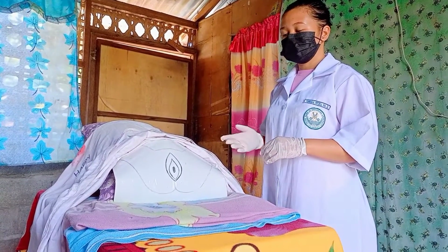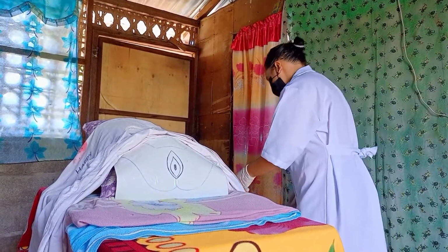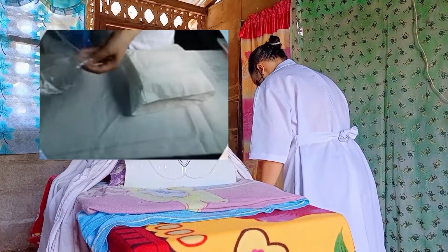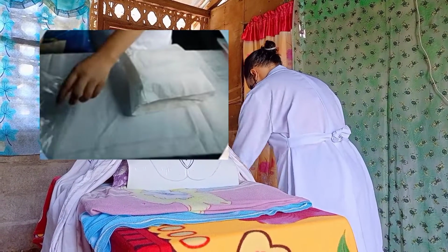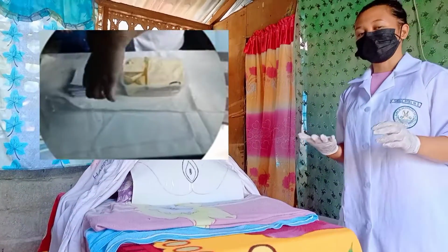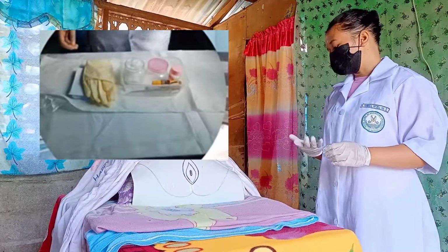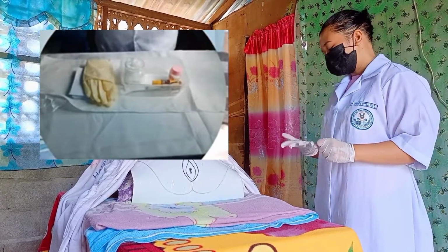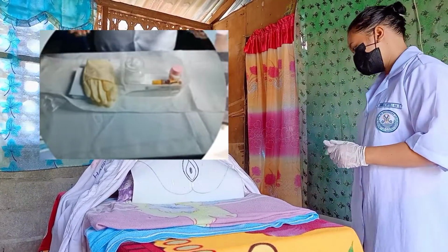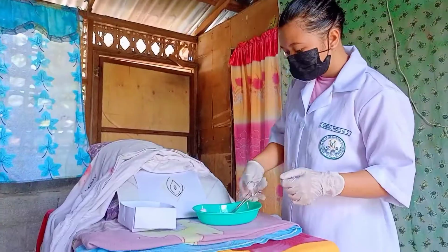Also, I assemble all my necessary equipment to save time and effort. So, organize the working area for the urinary catheterization. Position the plastic bag or any waste receptacle so that you will not have to reach across the sterile field. And also, arrange the bedside table or the overbed table within your reach to avoid carrying contaminated objects above a sterile field. I assess also the perineal care.